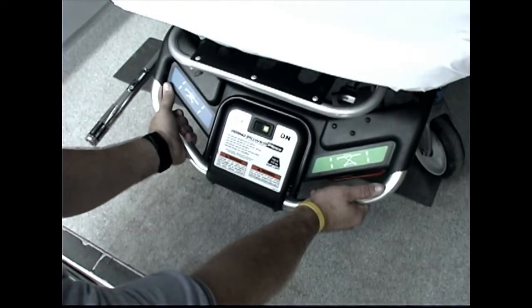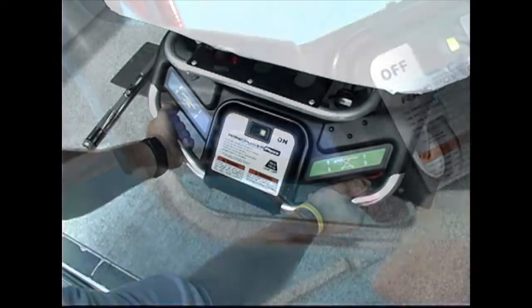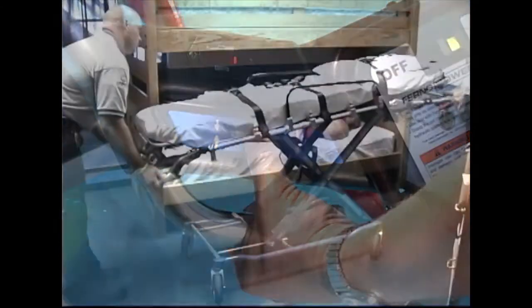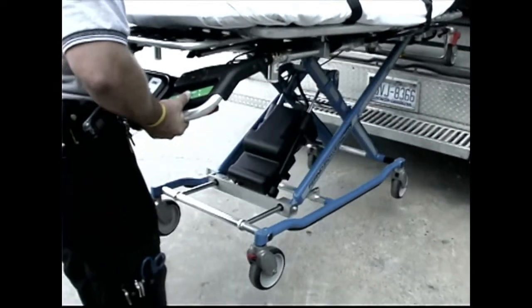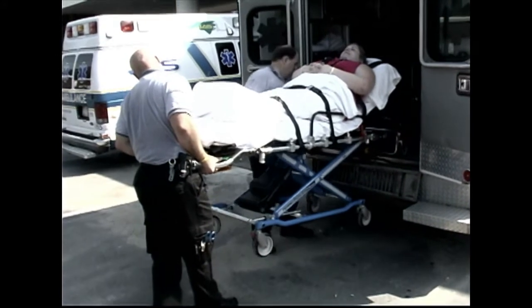Grasp the main frame and position your hands so you can access the touch pads with your thumbs. Press any part of the blue touch pad on the operator's left to lower the cot, fold the cot, or load the cot into an ambulance. Press any part of the green touch pad on the operator's right to raise the cot or extend the legs when unloading the cot from an ambulance.